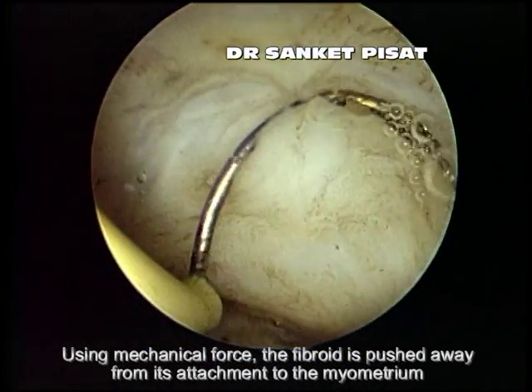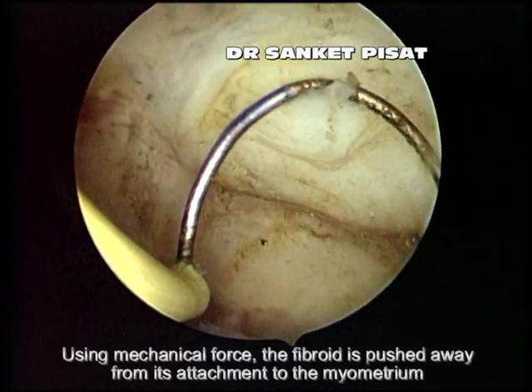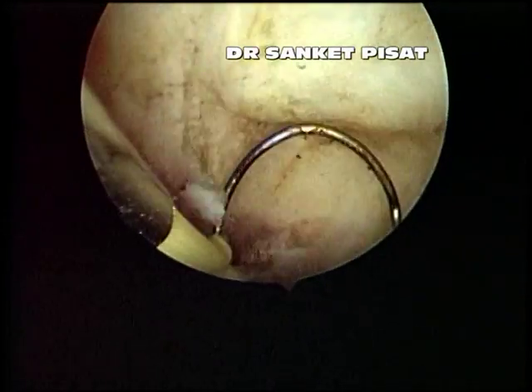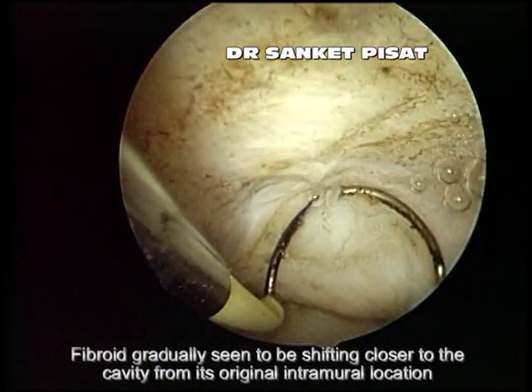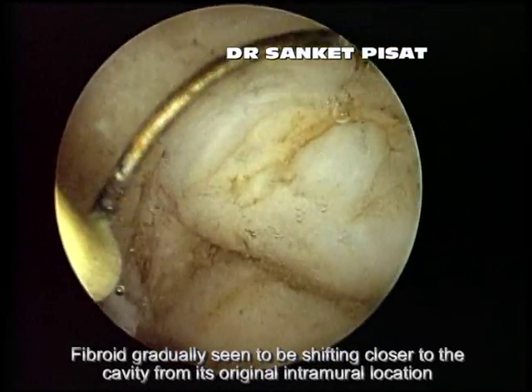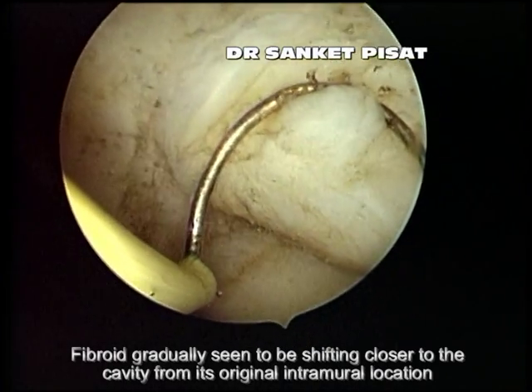Using mechanical force, the fibroid is pushed away from its attachment to the myometrium, and gradually the fibroid is seen to shift closer to the endometrial cavity, moving away from its attachment to the normal myometrium. This displacement is accompanied by short bursts of energy in order to release the fibroid from the fibers over the circumference of the fibroid that are holding it back.